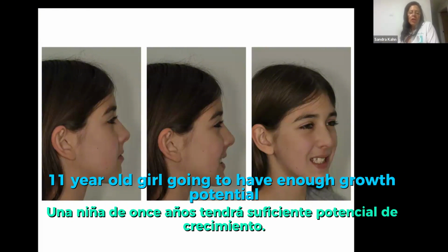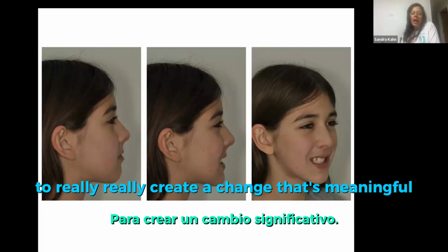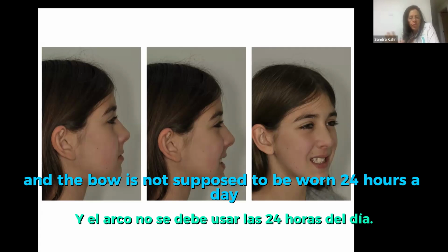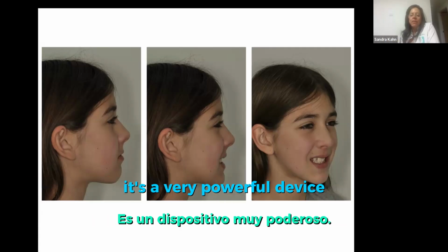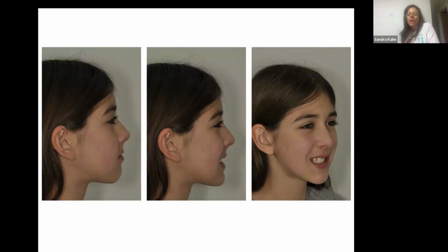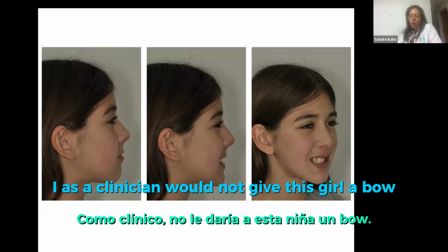Is this 11-year-old girl going to have enough growth potential to really create a change that's meaningful, even if she wears the bow 24 hours a day? And the bow is not supposed to be worn 24 hours a day. It's a very powerful device, and it has a huge vertical component. So, in my opinion, I, as a clinician, would not give this girl a bow.